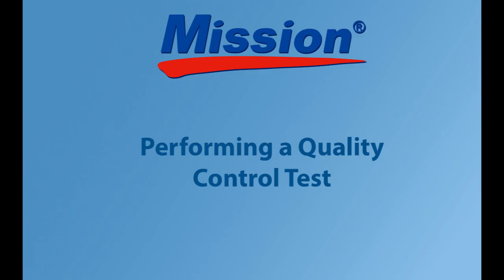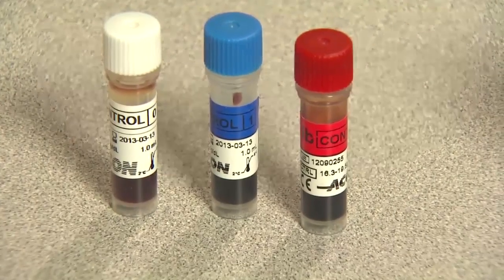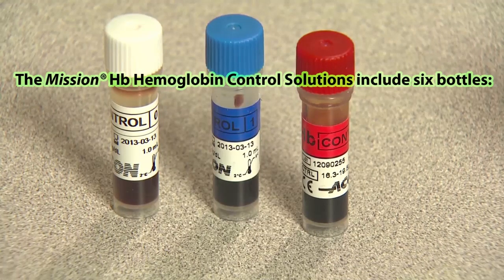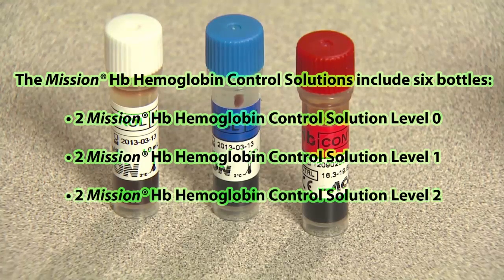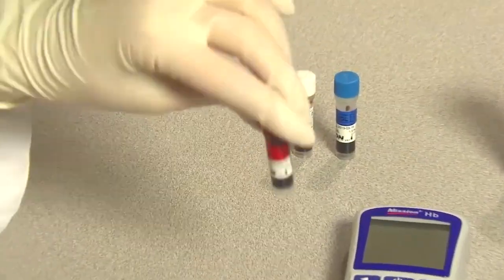Performing a quality control test. A quality control test is performed to ensure that the test strips and the meter are working together properly and that you are performing the test correctly. Mission HB hemoglobin control solution testing is performed in a very similar manner to blood tests, using the Mission HB hemoglobin control solutions instead of blood. The Mission HB hemoglobin control solutions include six bottles: two Mission HB hemoglobin control solution level 0, two level 1, and two level 2. Allow all test materials to reach a temperature between 59 to 86 degrees Fahrenheit (15 to 30 degrees Celsius) prior to testing.